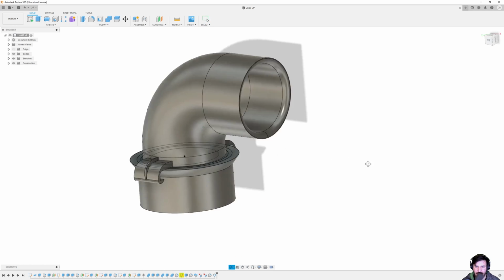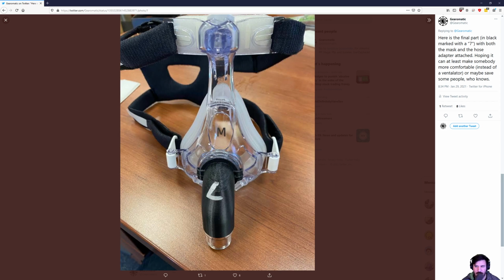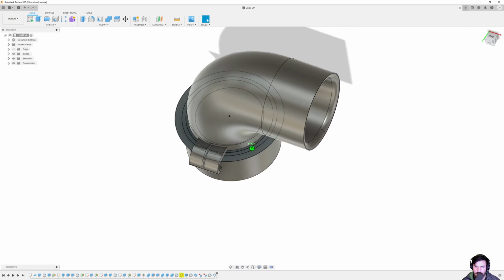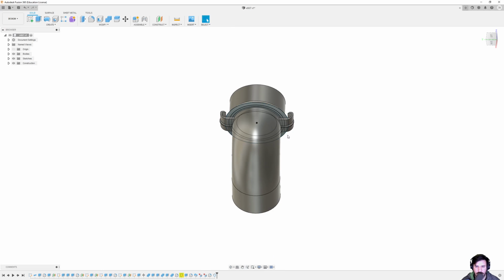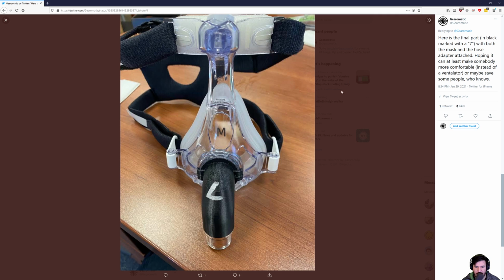This printed up fine. I have this picture in here of what it looks like. I just tried to rotate it. I can't rotate a picture, but you can see those clips here and there. This is the underside where it was held up with supports. So in that picture, it is looking like this, basically, more or less. Just about like that. But it was version 7, as you can see here.